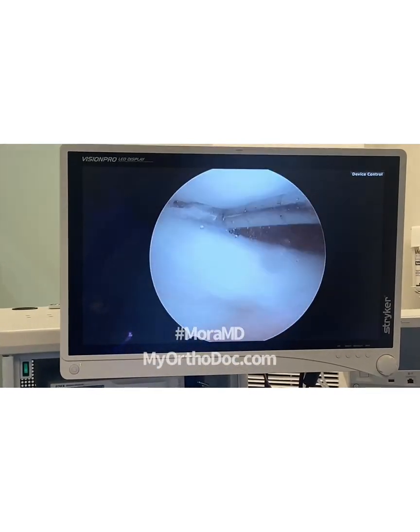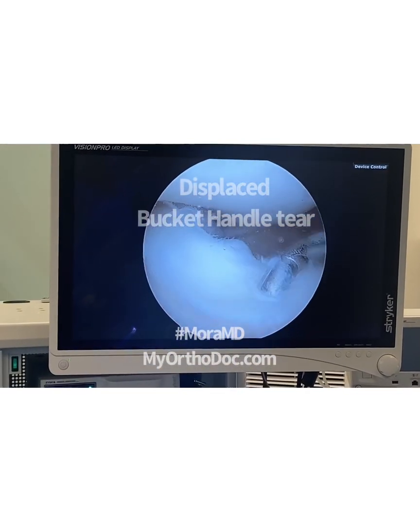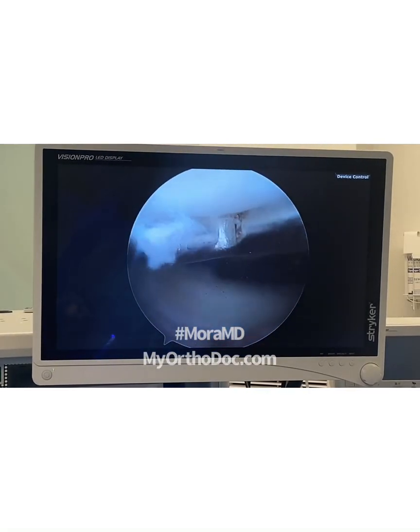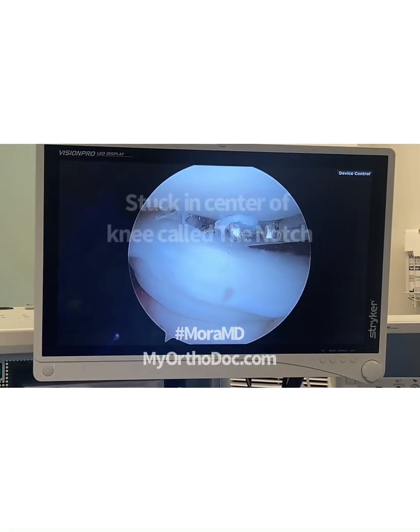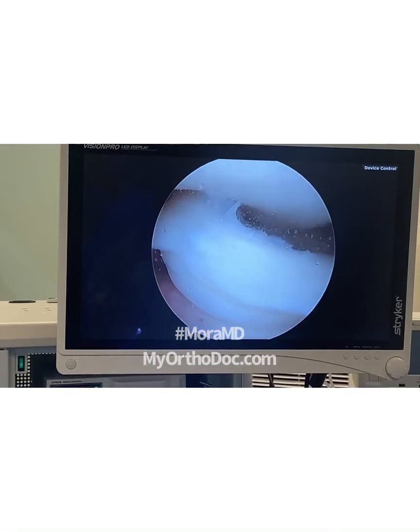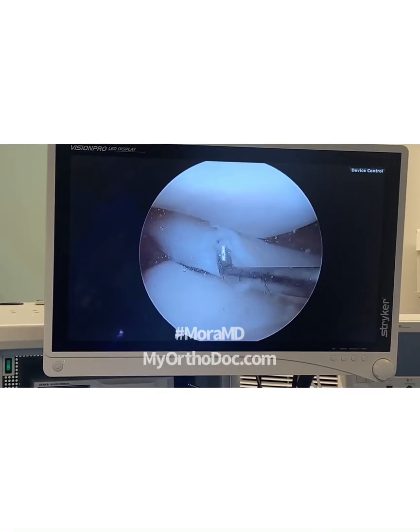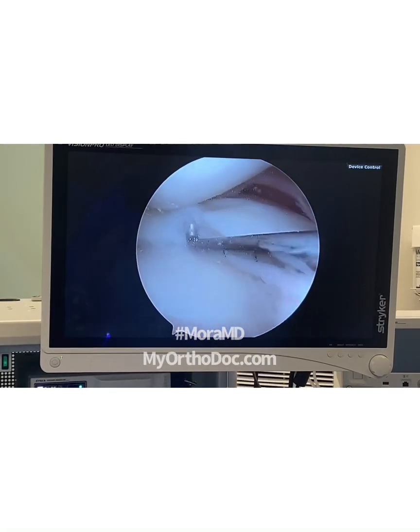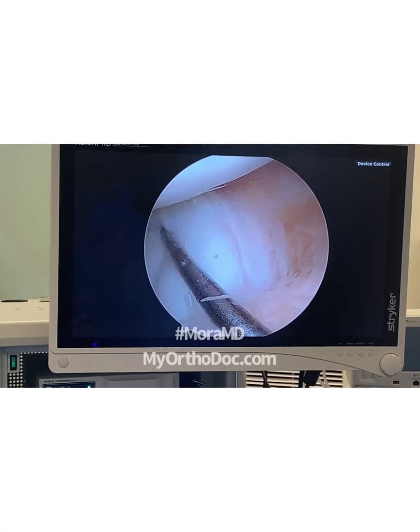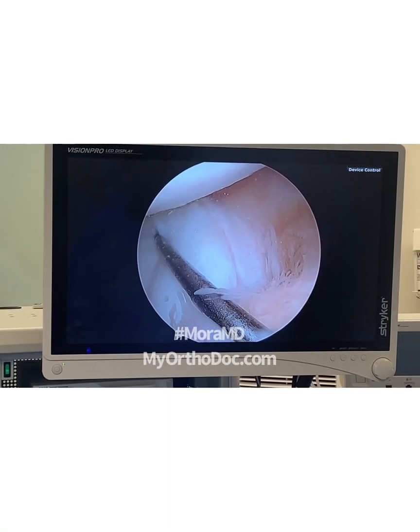We have what's called a bucket handle tear. This structure right here, it's soft, is between the two bones of the knee, but it's not supposed to be here. And as you can see, it's got a rainbow shape to it. It's actually the medial meniscus, and it's supposed to be over there. You can see the rip right there. This is called a bucket handle meniscus tear.